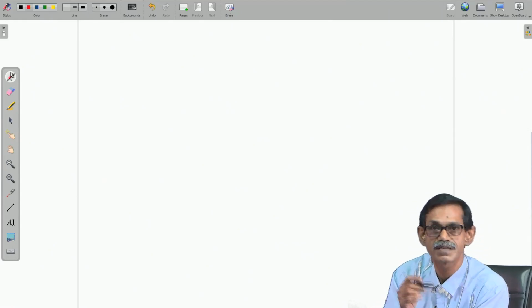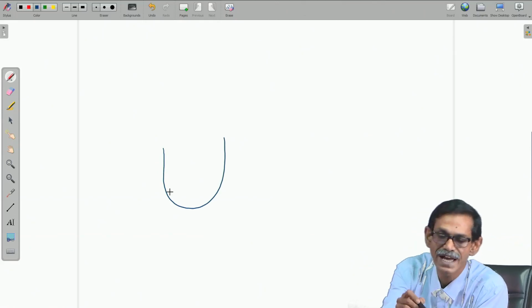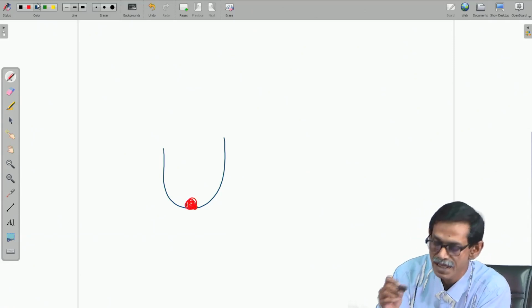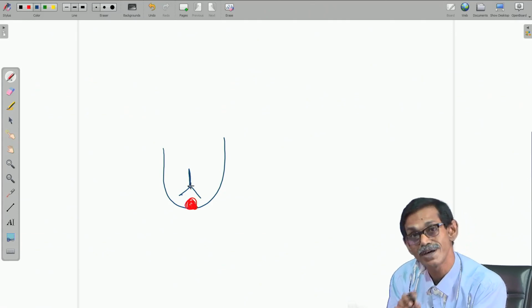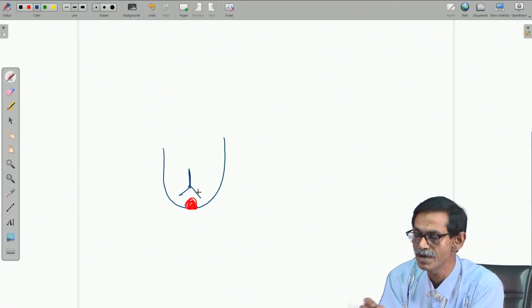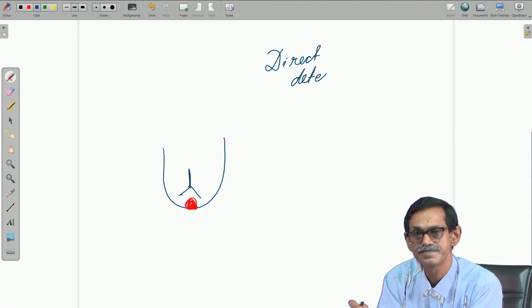So, in this case, in this well we had antigen. Okay, I am just drawing one now, just for ease. You had antigen, then we had an antibody which was labeled with an enzyme. When the first antibody is attached with the enzyme, we call it direct detection.